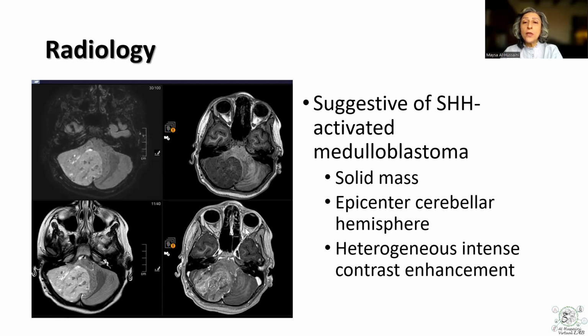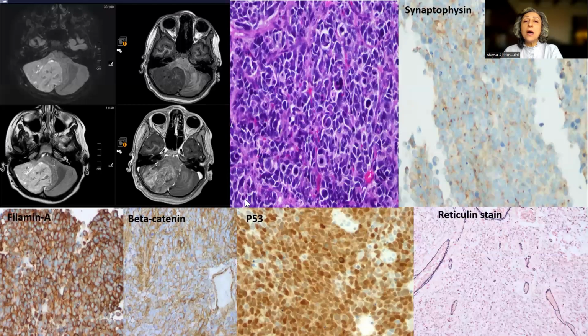So if we just sum up the case, the radiology is suggestive of SHH-activated medulloblastoma. The morphology is large cell anaplastic, showing dot-like cytoplasmic positivity with synaptophysin immunohistochemistry.